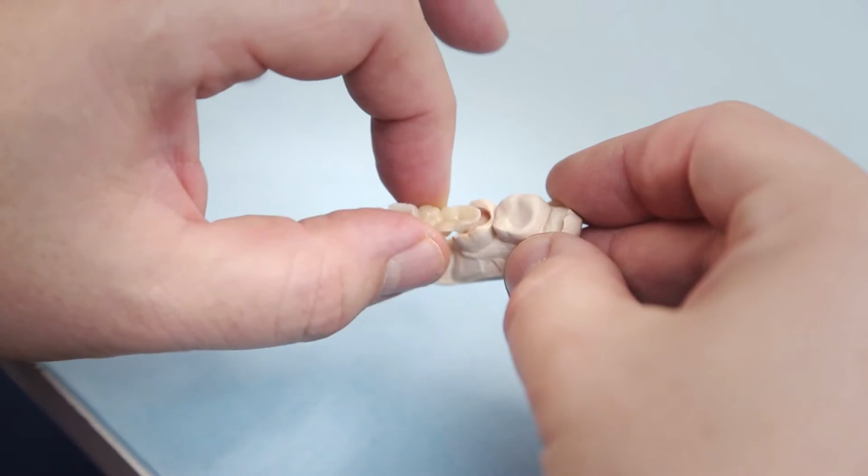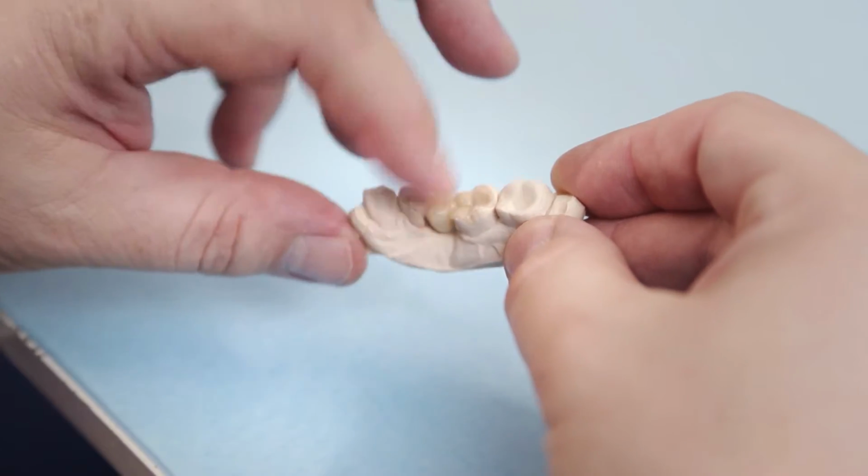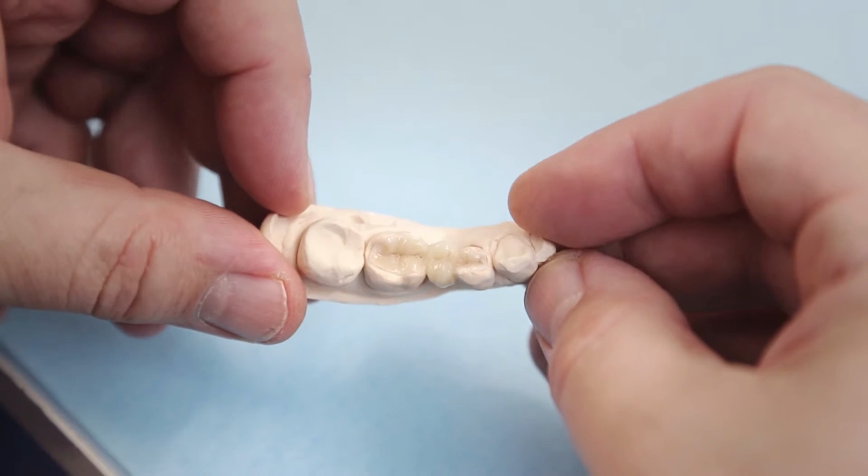In my opinion, there is no longer any reason to use gold alloys as the framework material for permanent dental prostheses, especially since they have become so expensive with the high price of gold. It used to be the other way around. Then, a zirconia restoration or framework was much more expensive than a gold framework. But the higher price of gold and the much higher number of zirconia restorations requested in labs have evened this out, so that today you can certainly offer a zirconia restoration at a lower price than a veneered gold alloy.